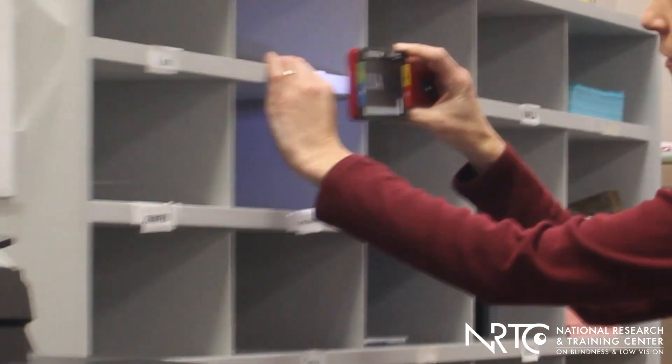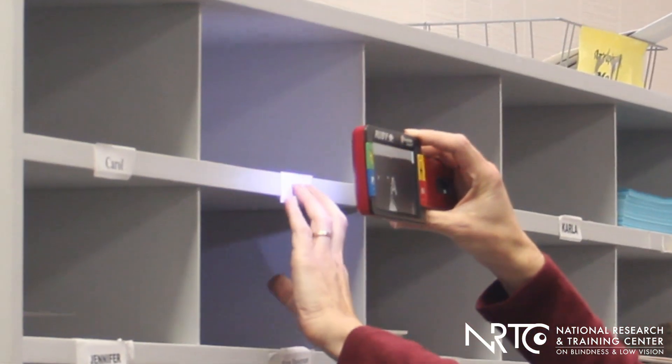While video magnifiers that are smaller are better for taking to the store to read labels, or maybe to the workplace to look at items in the storage cabinet for the office supplies, or reading the mailbox labels to make sure you're putting things in the right mail slot, or maybe reading through the flyers that came in the mailbox itself.